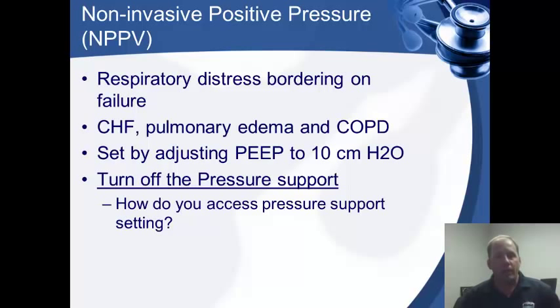There are times where this non-invasive approach is not effective because it's not instituted early enough. Maybe the patient waited too long to call us. In those cases, you're probably going to have to resort to BVM, intubation, and setting them up on the vent on assist control and volume setting.